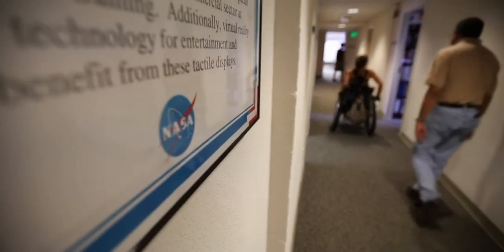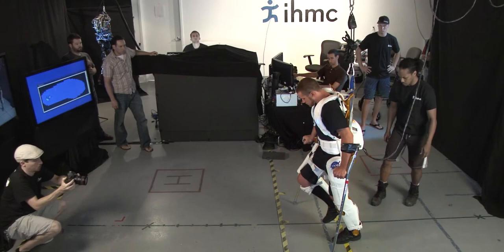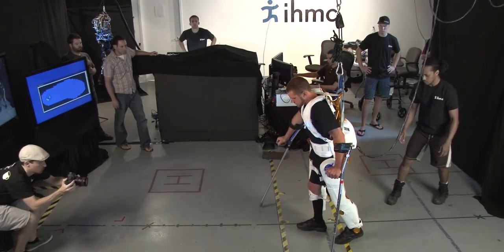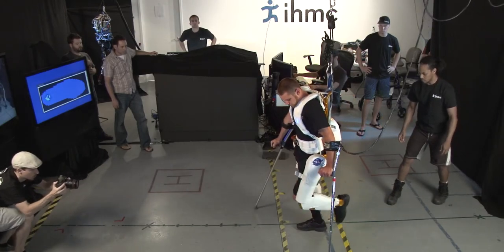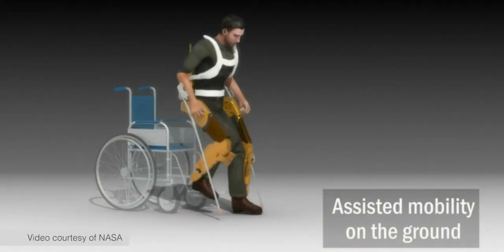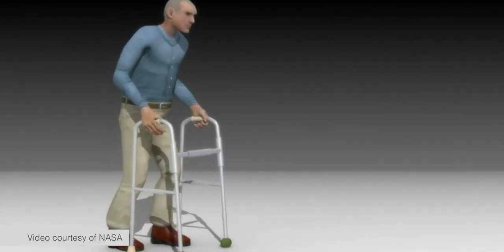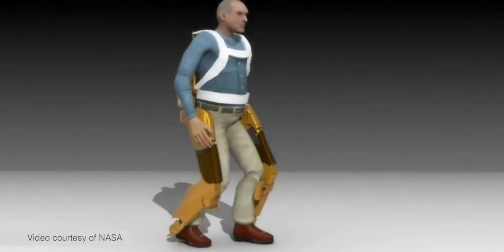The X1 device was designed to be a research tool for human-assisted or wearable robotic research. One area includes mobility systems for someone with paralysis, but we also designed it to be used with able-bodied people — it could either provide assistance to their motions or resistance to their motions.